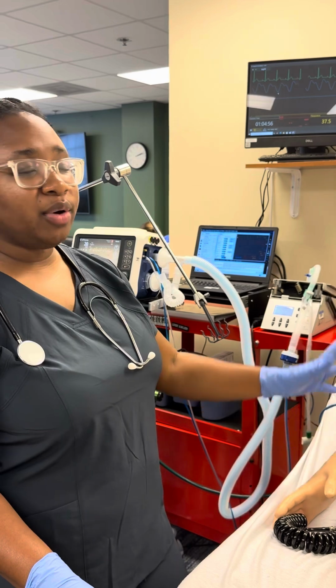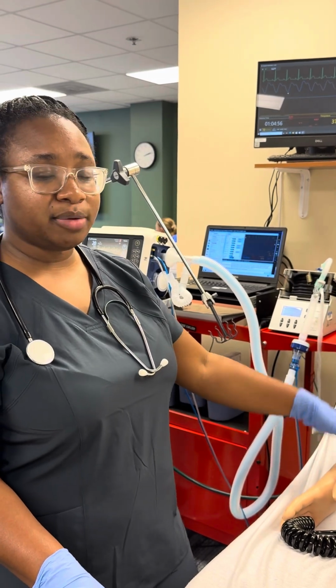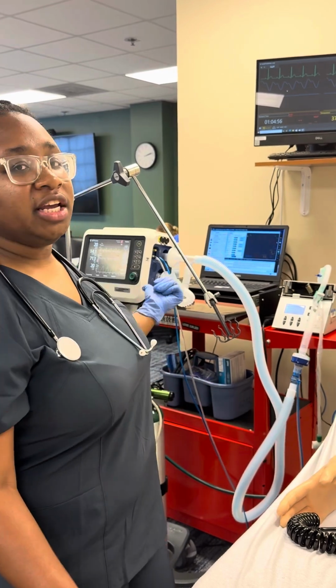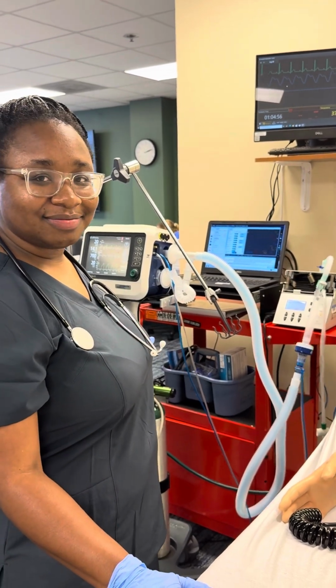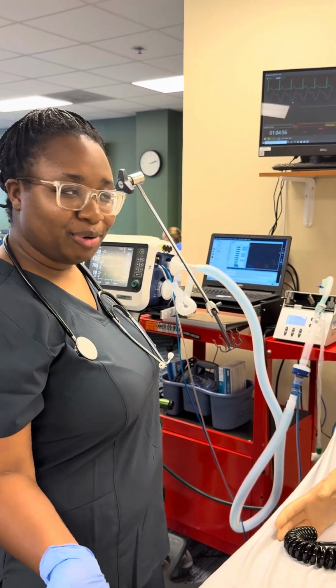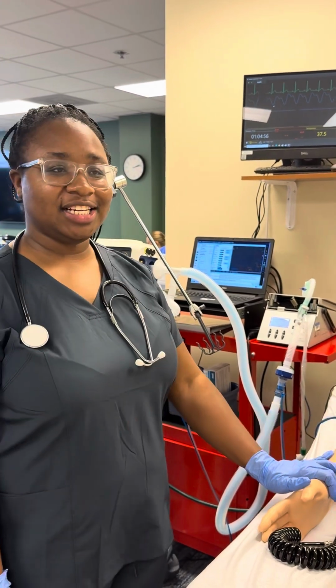To do that, I'll increase Miss Haley's FiO2 to improve her oxygenation. And then I'll go in and change her heart rate. Not her heart rate, her respiratory rate, to improve that as well, improve her oxygenation.